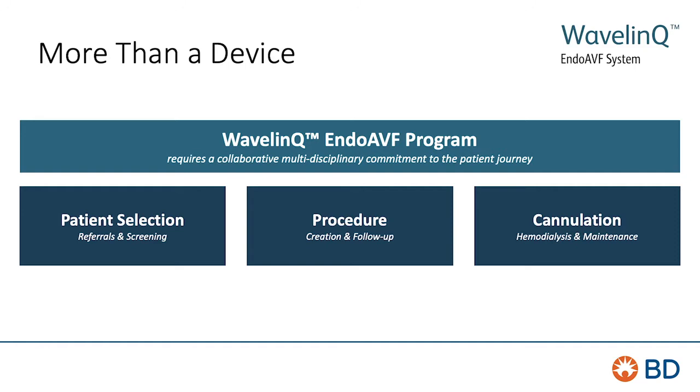And so we upgraded our techniques by bringing an enhanced ultrasound console into the operating room, having the ultrasound techs present in the operating room, using ultrasound to clarify that our wires were intraluminal rather than doing contrast injections. And this has greatly enhanced our ability to successfully create a fistula.